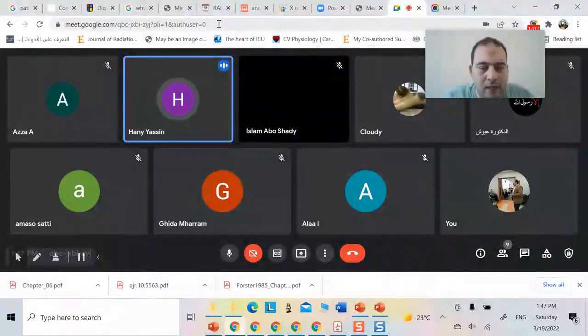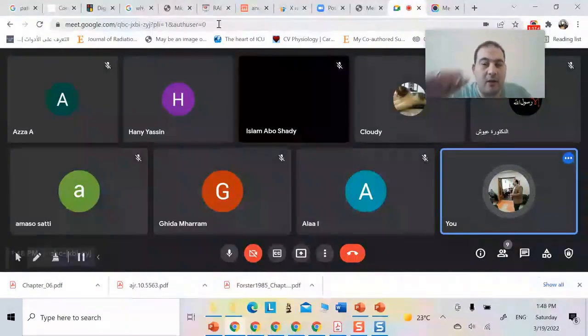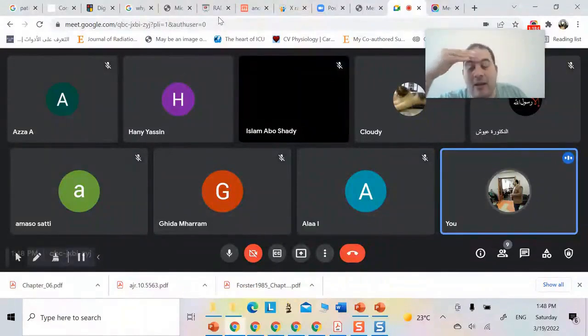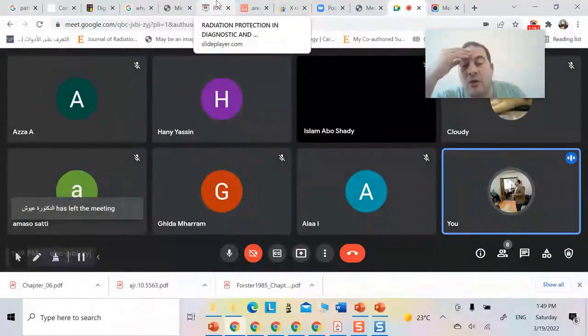In terms of mammography, pixel size is essential. The pixels I will use in the matrix need to be small enough so that I can achieve the best resolution. If your pixel size is large, it doesn't just affect the pixel size, but also the number of bits, or the bit depth we were discussing, which relates to dynamic range. Remember when we said that I can reach a certain number of bits within the pixel? It needs to be high. The image matrix's highest quality is represented by the number of line pairs, which relates to the MTF we discussed. It can reach about 12 line pairs per millimeter, and the number of bits can also reach around 12 bits per pixel. The number of pixels in the image itself will be approximately 1024. So even to take a single image, the image value is very high in breast images.